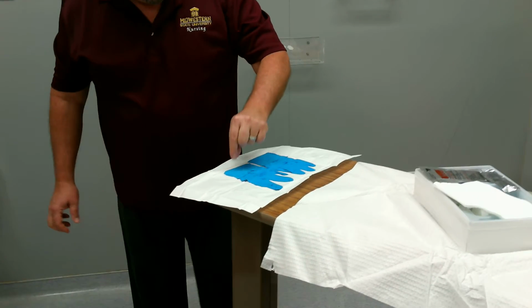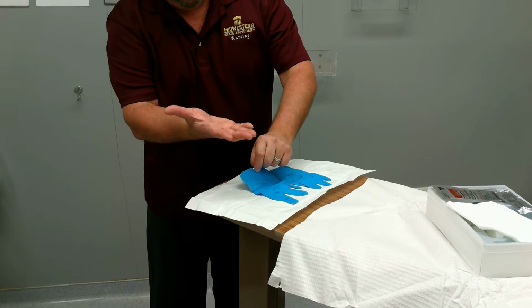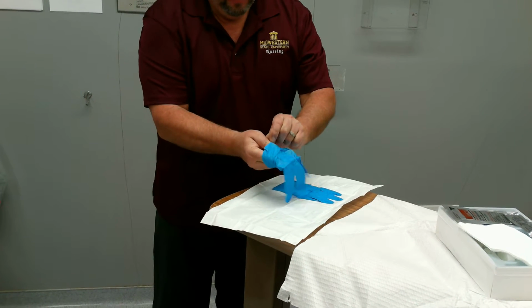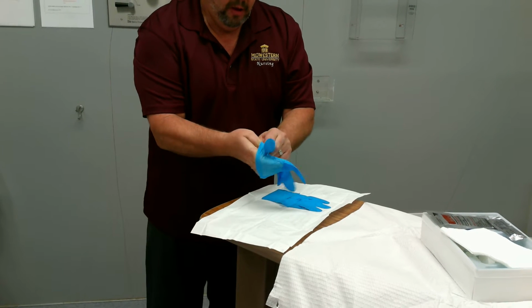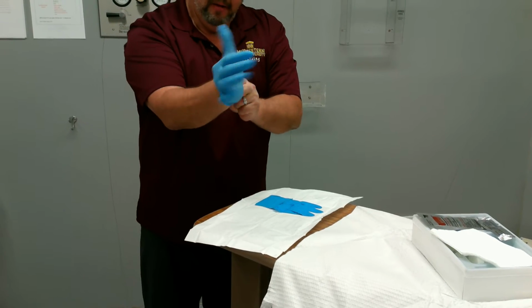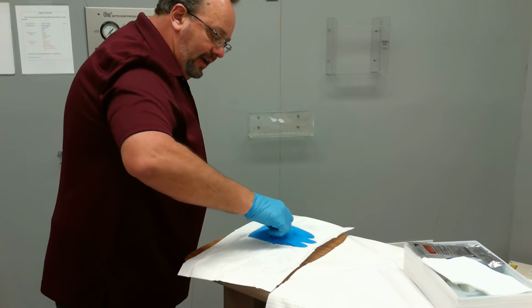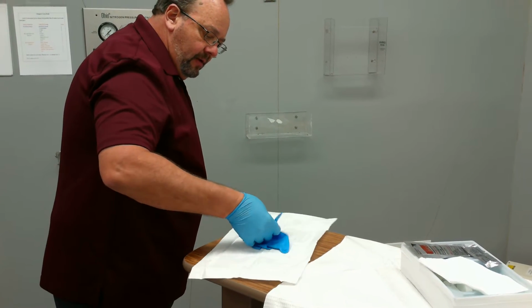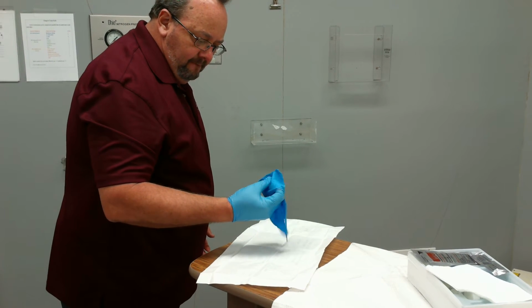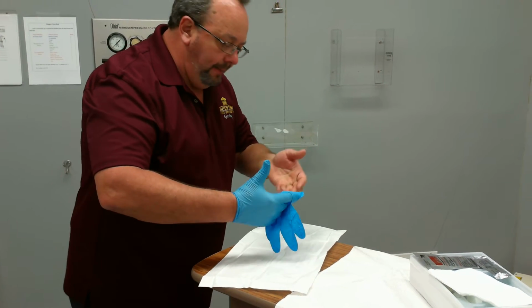First one, I'm going to grab the cuff and pinch the cuff, knowing that these are set up with my palms up, thumbs out, slide this first hand in there. Then once I've got that on, now I take these fingers and I slide under this cuff. And then put my hand in, keeping my thumb up.